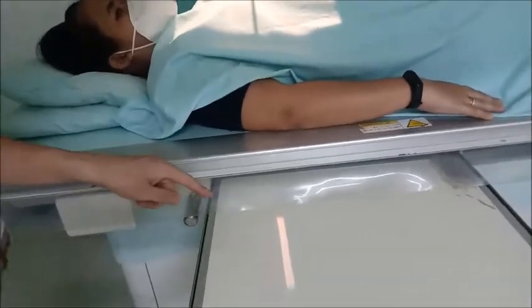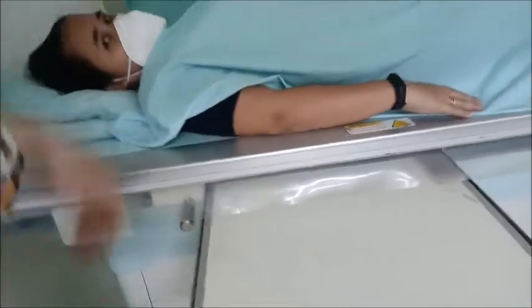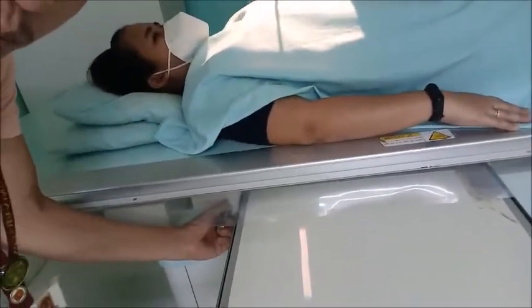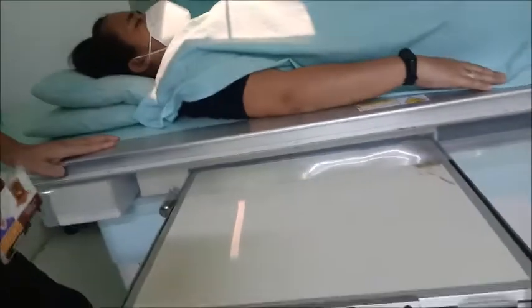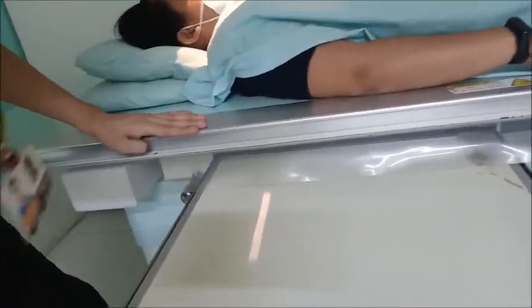Okay. So dili na nako mamove ang ako ang IR pasaka siya. So what to do for this type of problem? So again, move the patient.